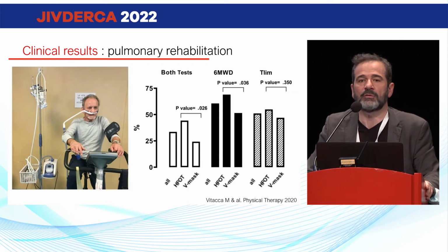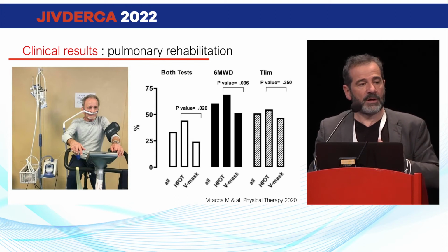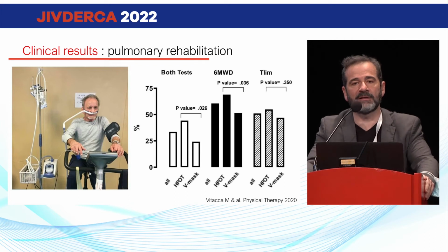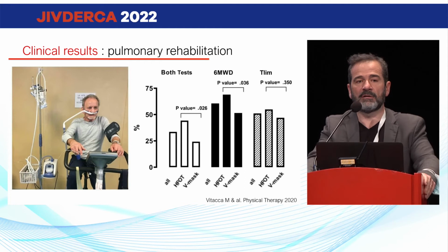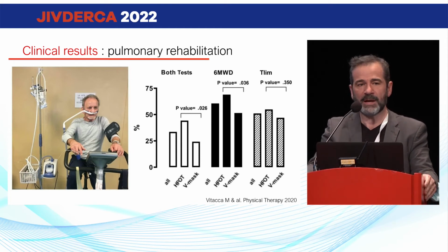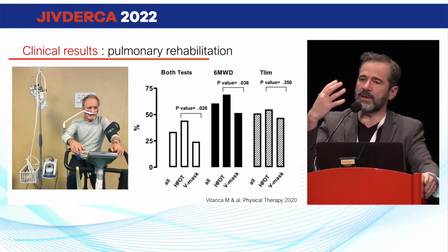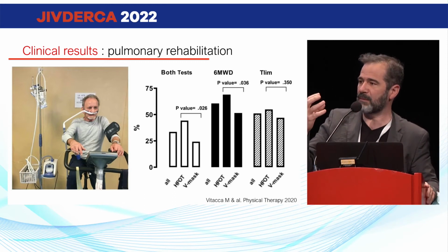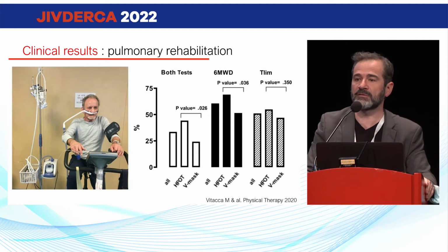And I am very embarrassed with that because I see these positive results, as shown very well by Annalisa, and I will ask her later if she uses it in a rehab center, because in mine, I am not able to use it. Really, patients don't like it. I don't understand. It's true that we sometimes use fans when the patient has dyspnea, 10 euros on Amazon. You use a fan, it's a flow, and the dyspnea of the patients decreases.